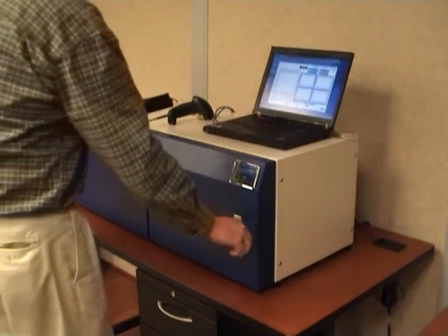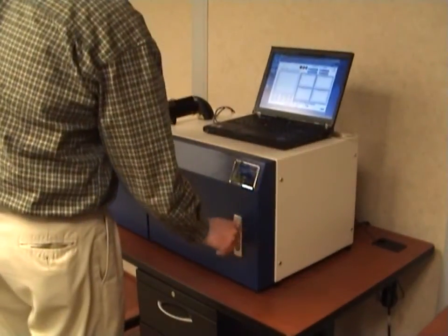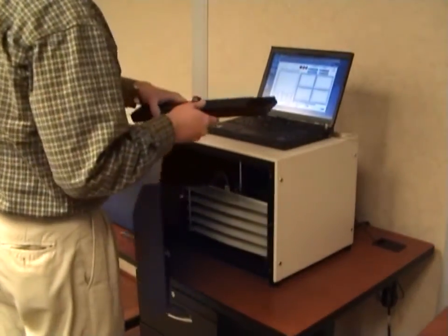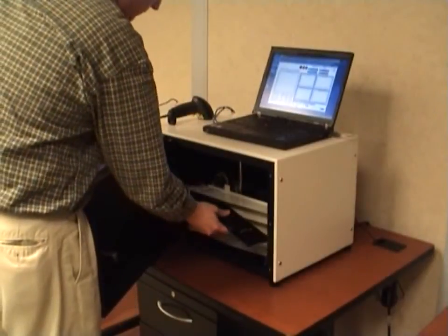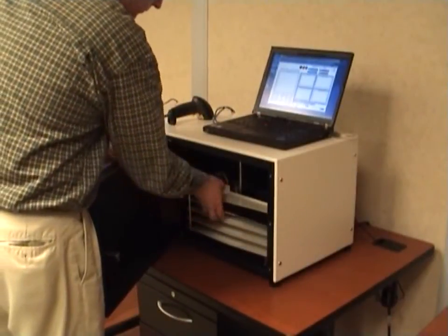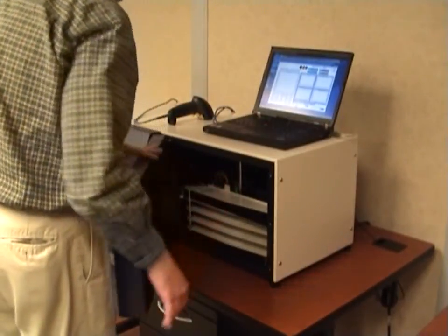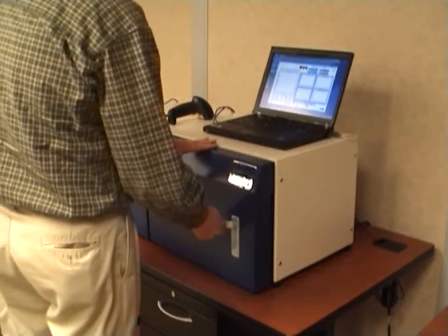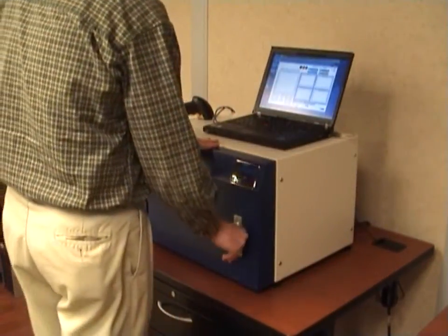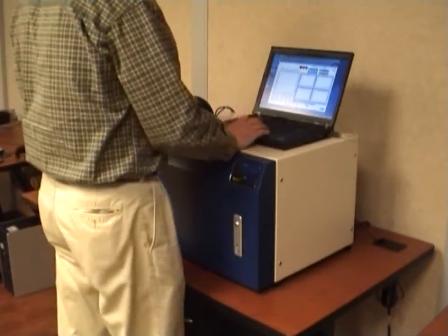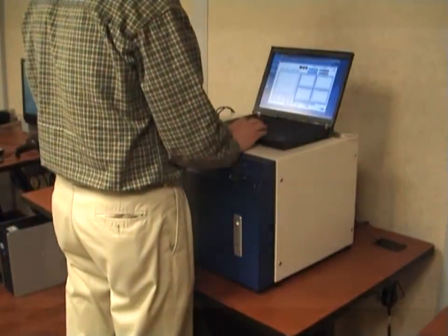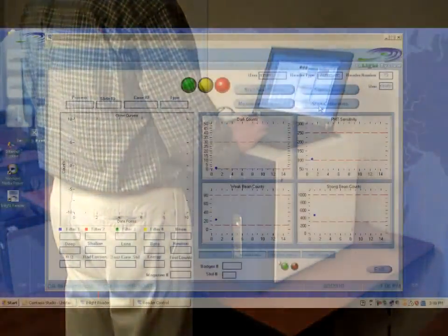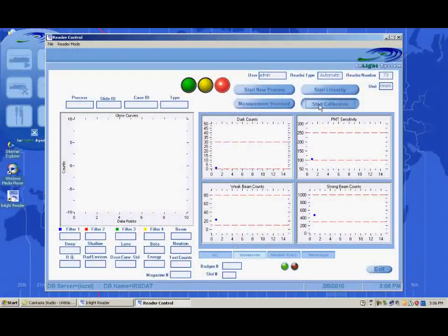To calibrate, place the calibration dosimeters into a reader magazine and place the magazine into the InLight Reader. From the reader screen, click the Start Calibration button.